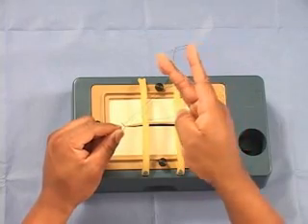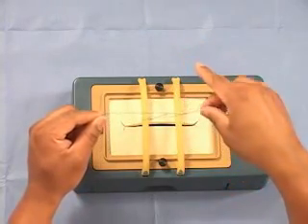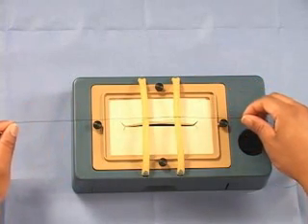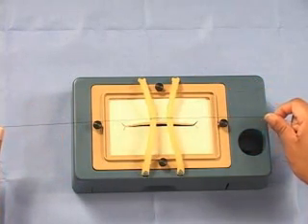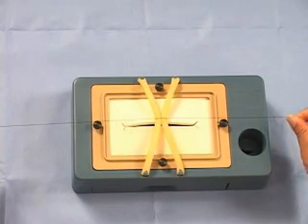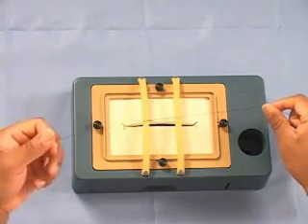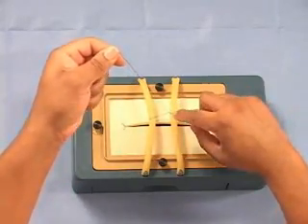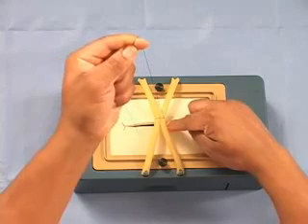If you rotate your hand palm down and come through the loop, you have just completed your first throw. Notice that this knot will go down flat. To do this throw correctly, you will pull up with your left hand or posting hand and push down with your index finger of your tying hand.